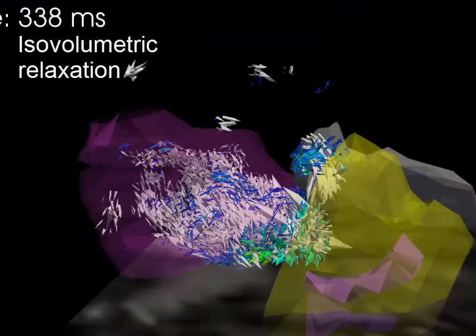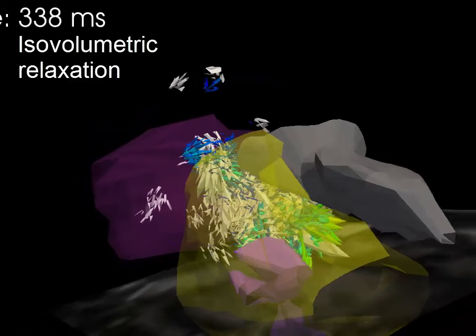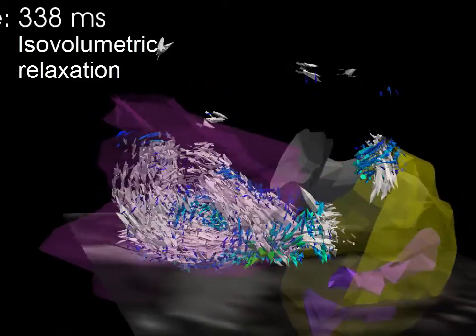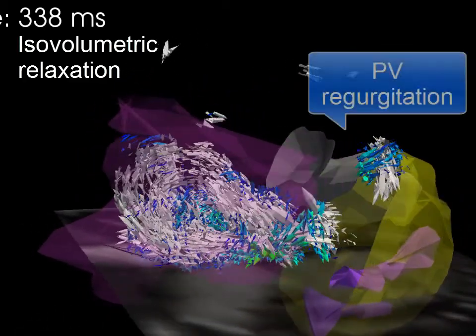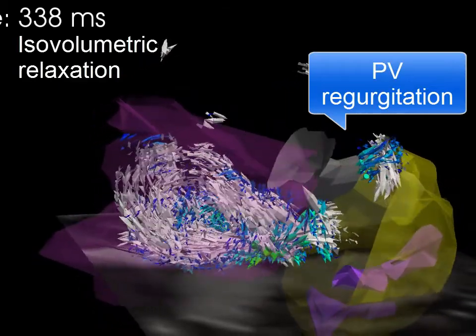At the end of systole, during isovolumetric relaxation, we see evidence of pulmonary valve regurgitation, but little other flow in the ventricle.